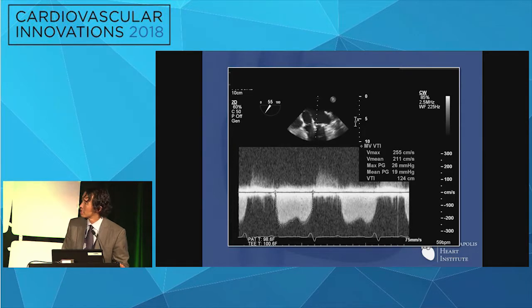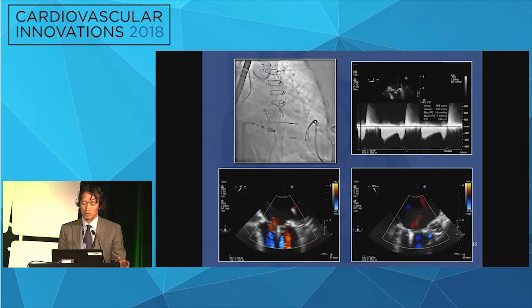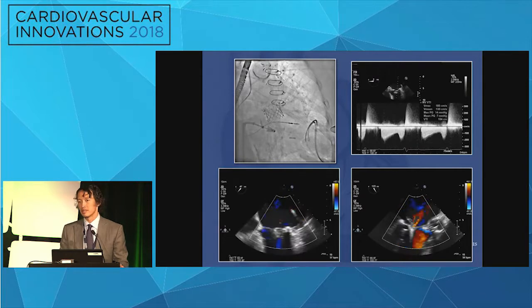So, Paul, you did this case acutely immediately post TAVR. Yeah. The patient was sick and all that stuff. That's right. So the chest is still open, TA is still open. Yeah, so I thought about that. I thought about letting the papillary muscle fly up. Maybe that's contributing to stenosis. So what I ended up doing is I simply just opened the arms up to about 60. And so that got the gradient down to around 7.